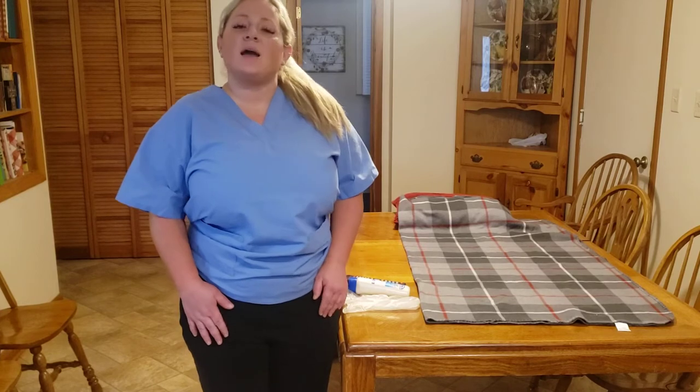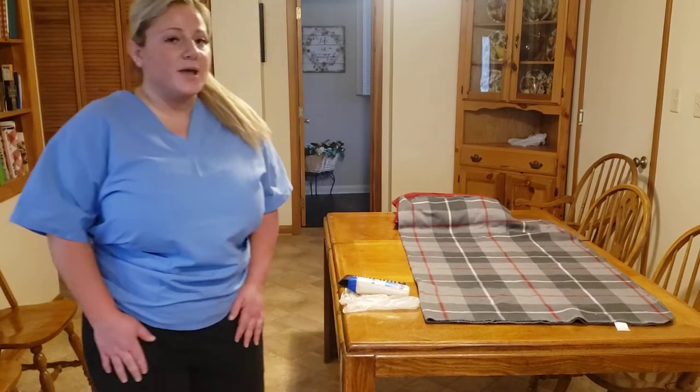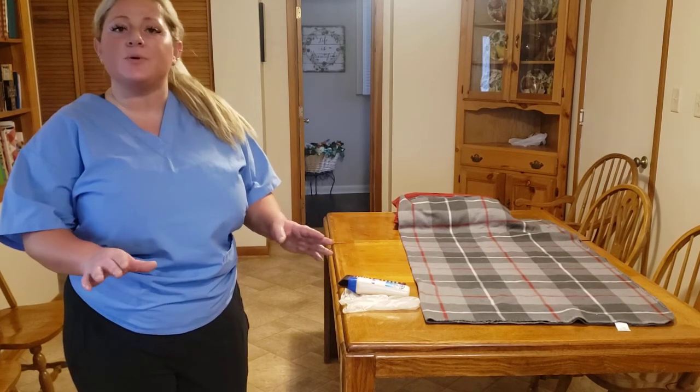My name is Ashley Gulati. I'm doing a CNA video on how to use a bedpan. I don't have a live model with me, so I'm just going to be doing it by myself.